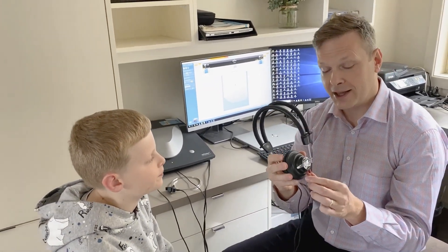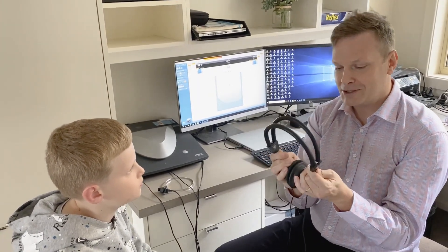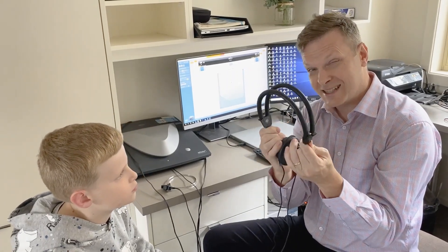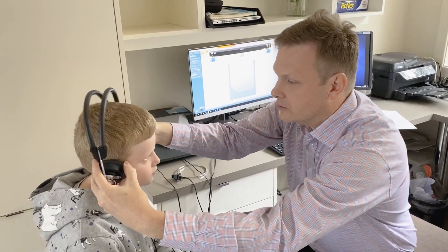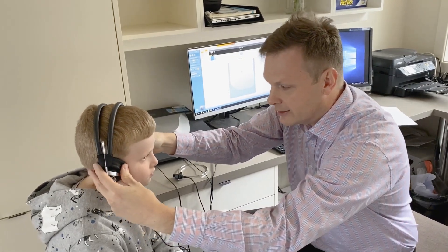We've got our headphones — they're colour coded. The right side is red and the left side has got the blue cord on it, so try not to get those mixed up. When putting the headphones on the patient, I normally like to have the headbands up as large as they can go, put them right on top of the head on the ears, and then pull the headband down so it's nice and comfortable and not going to move around.